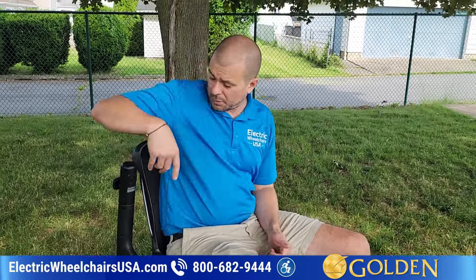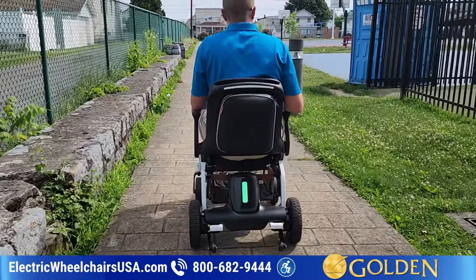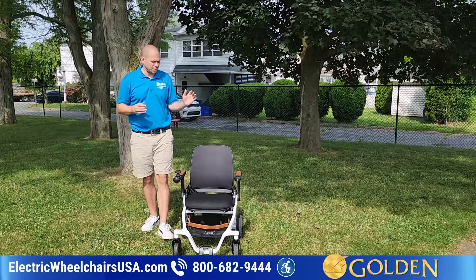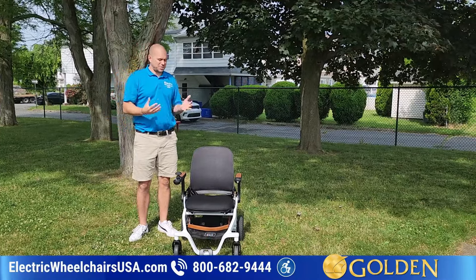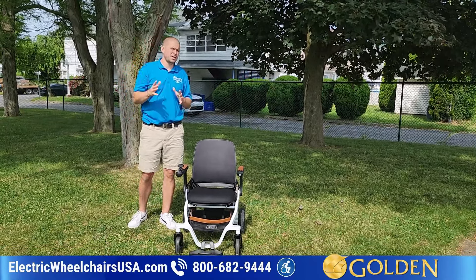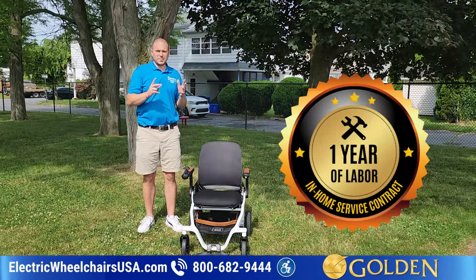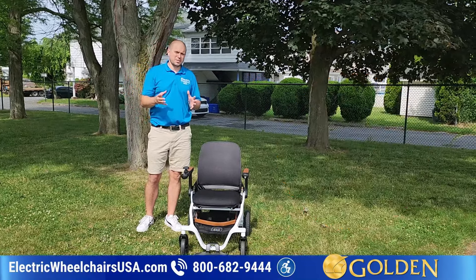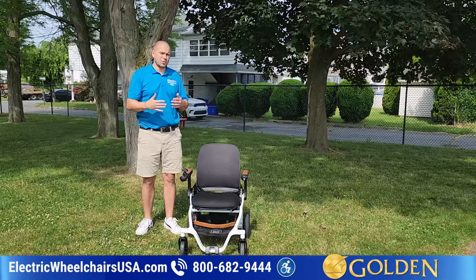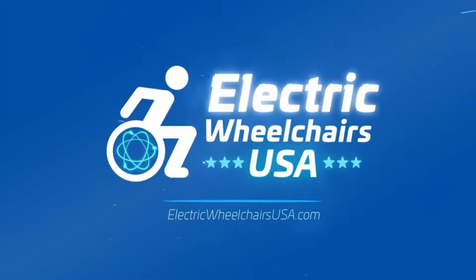Overall, it's a really cool chair — we really like it a lot. It's being distributed by Golden Technologies, one of the best brands in the industry. If you're looking for an awesome folding power wheelchair unlike any other in the industry — airline approved, super comfortable seat, and one of the more technologically advanced chairs available — the Ally is an awesome choice. Golden Technologies has been around for around 30 to 40 years, with excellent support and warranty. The warranty includes a one-year labor contract, so as long as it's approved by Golden Technologies, they will send a technician to your home for the first year to diagnose and resolve any issue. If you have any questions about the Ally or any Golden Technologies products, give us a call at 1-800-682-9444 or visit us at ElectricWheelchairsUSA.com.